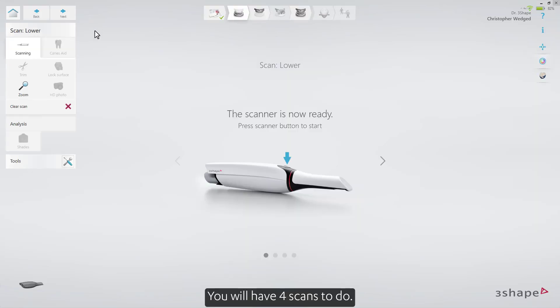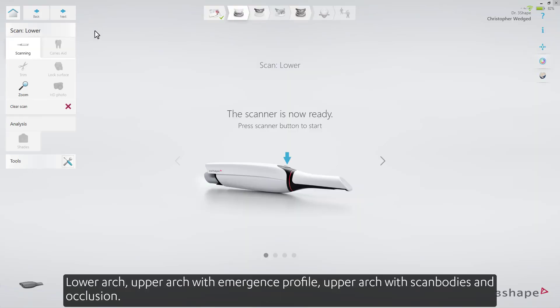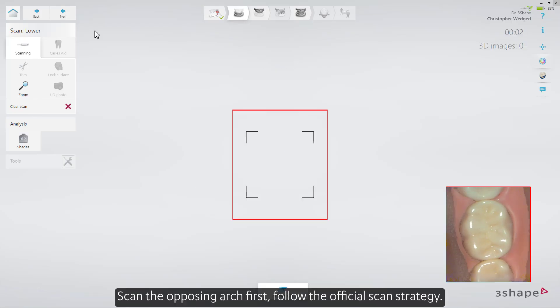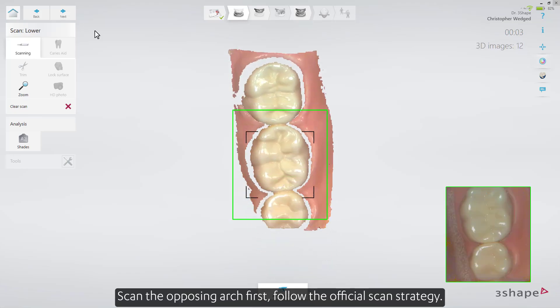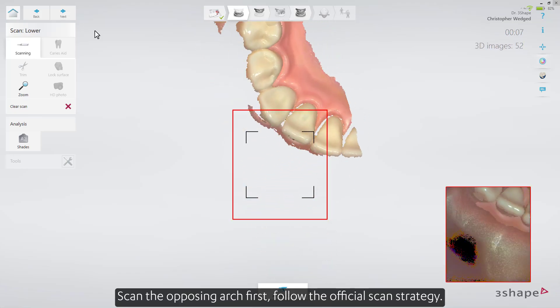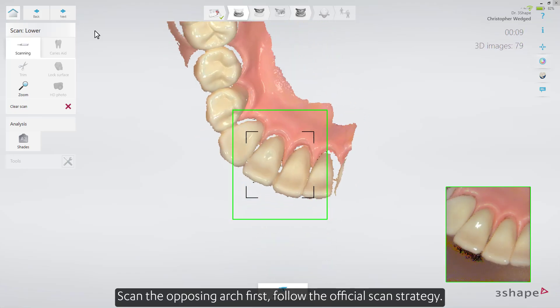You'll have four scans to do: Lower Arch, Upper Arch with Emergence Profile, Upper Arch with Scan Bodies, and Occlusion. Scan the opposing arch first. Follow the official scan strategy.